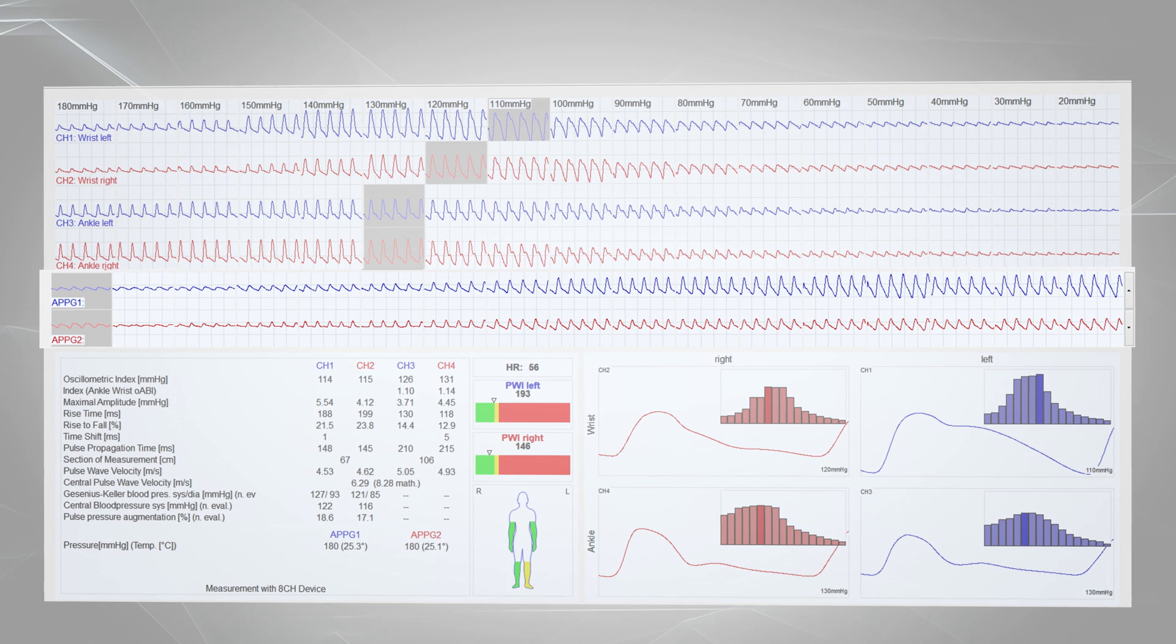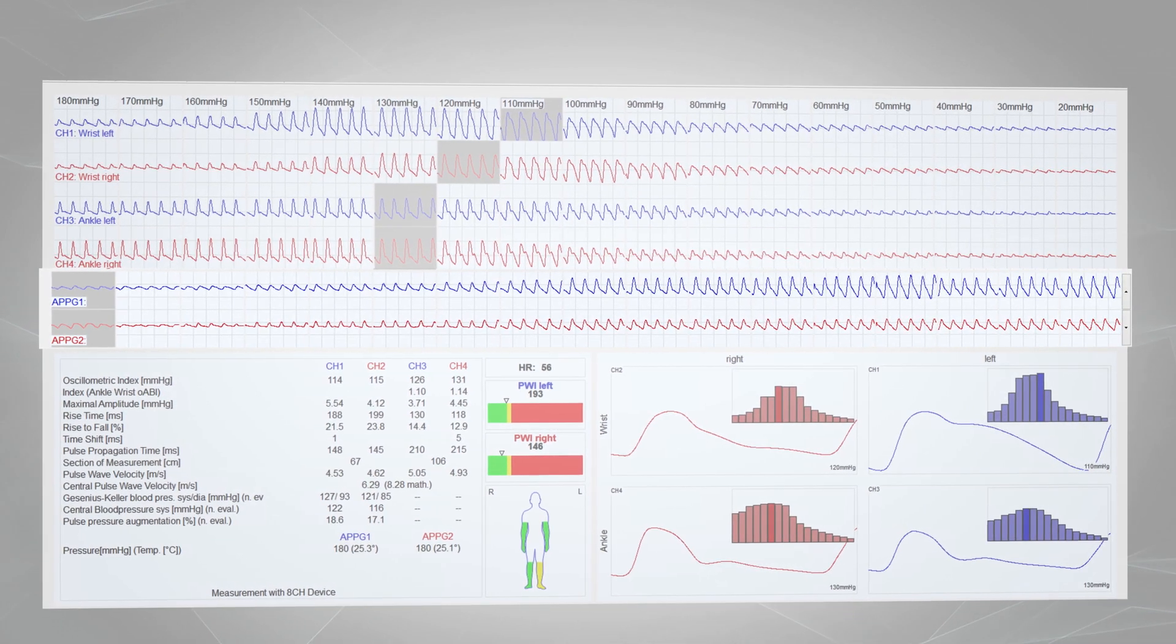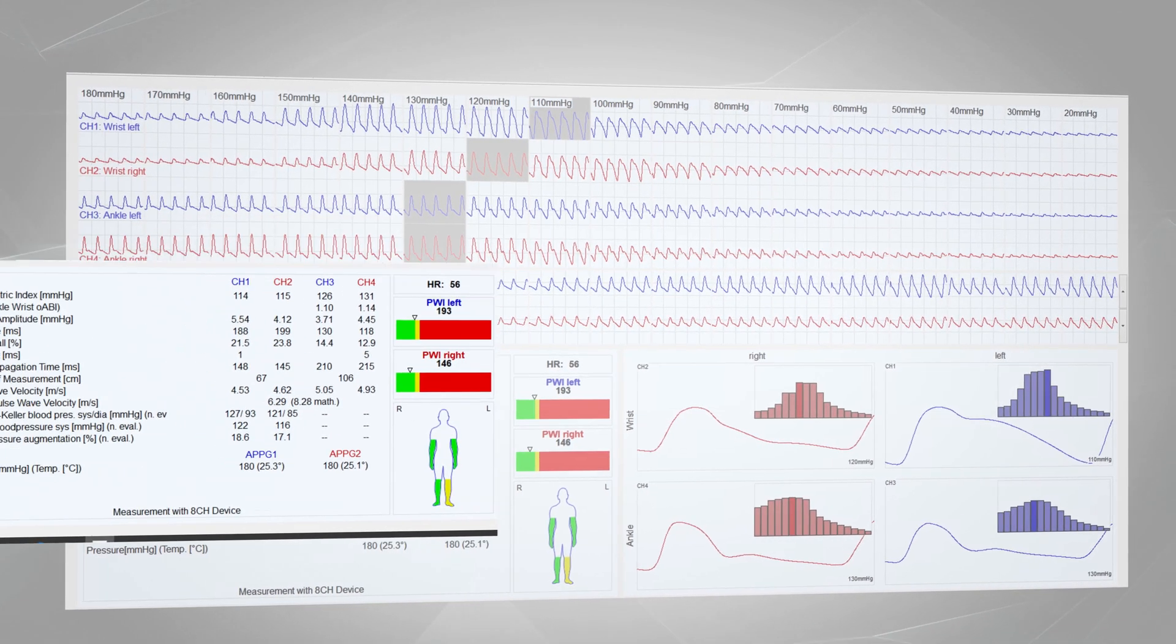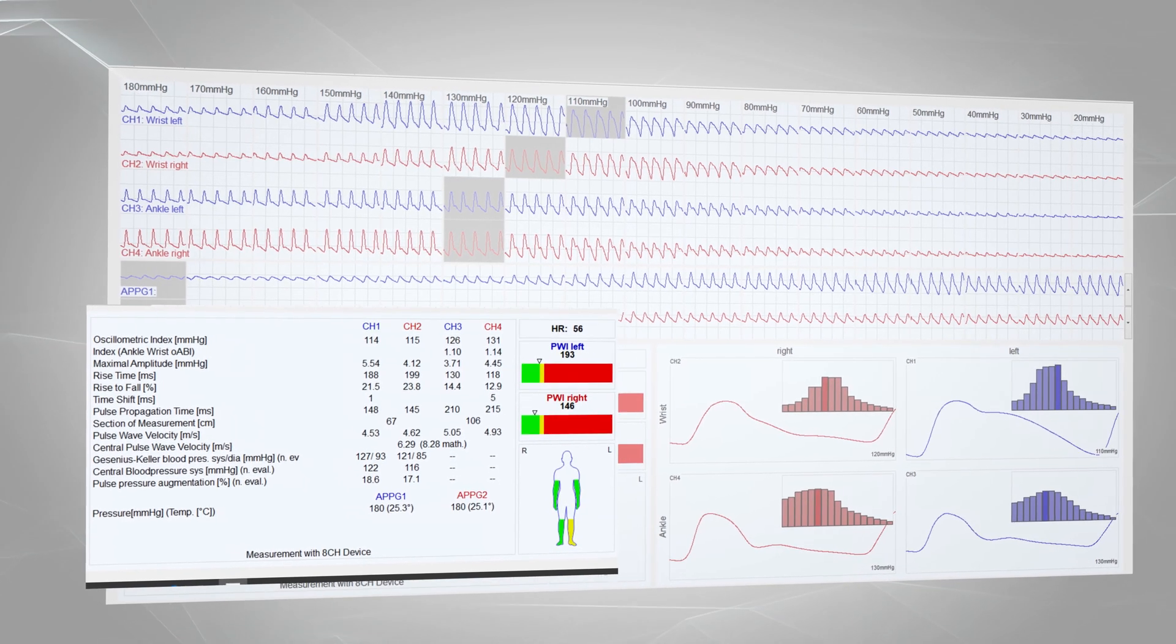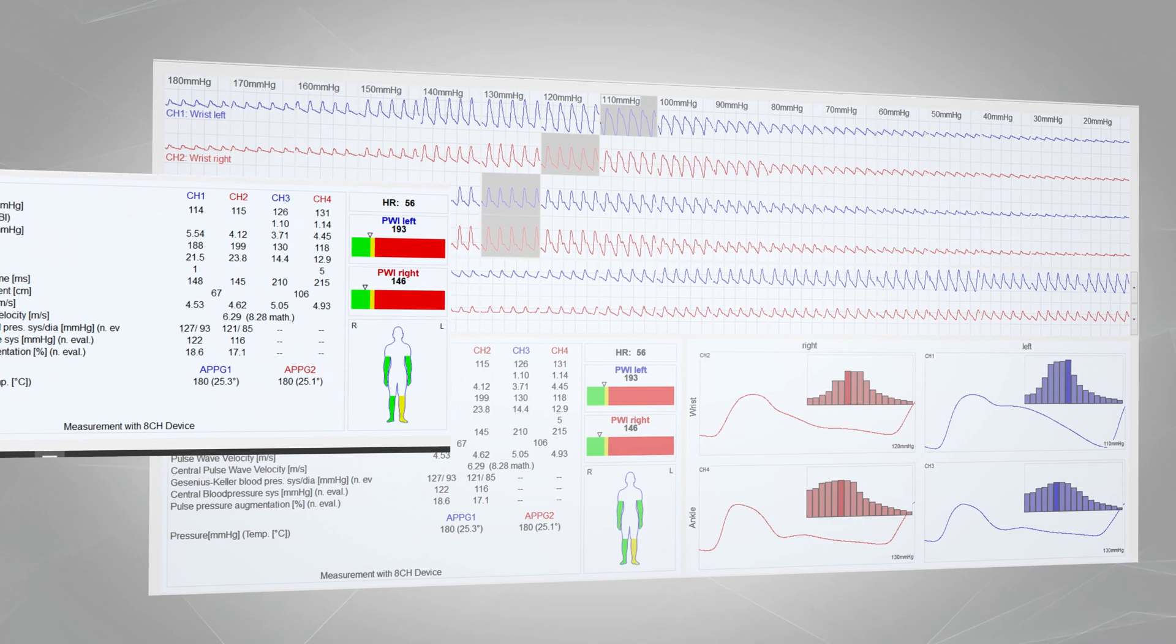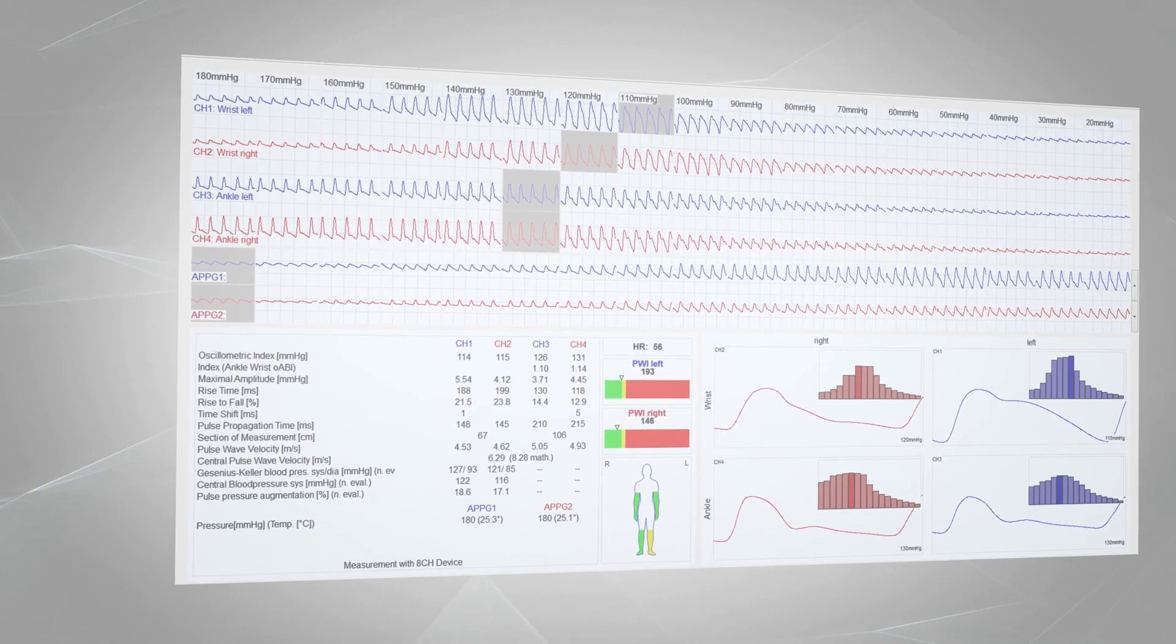By recording the optical sensors, it can be determined immediately at which pressure stage the first pulsation on the toes occurs. Simultaneously, various values such as ABI, pulse wave index PWI, peak time, pulse wave velocity, or heart rate variability are calculated and displayed.